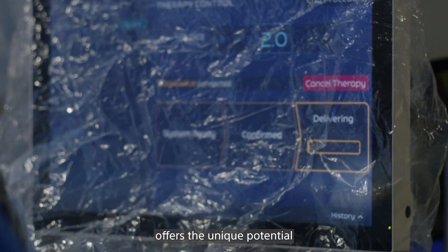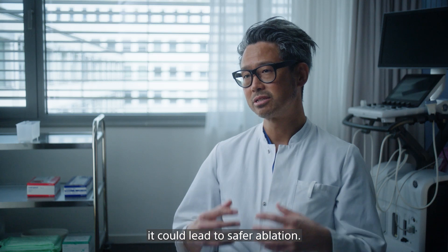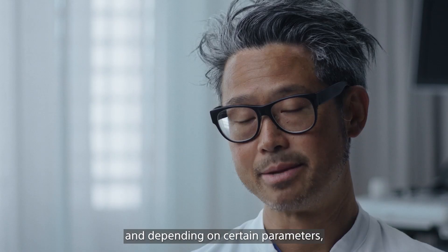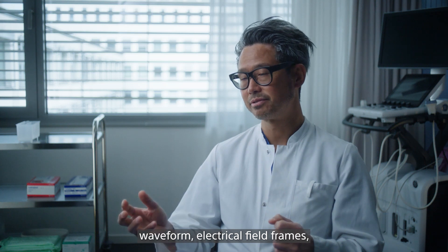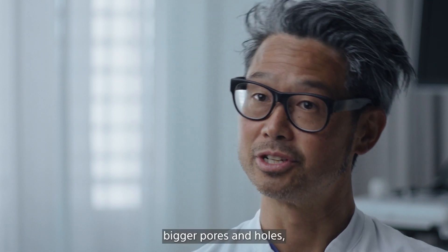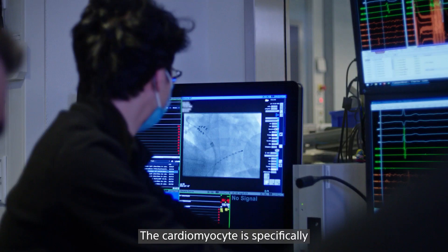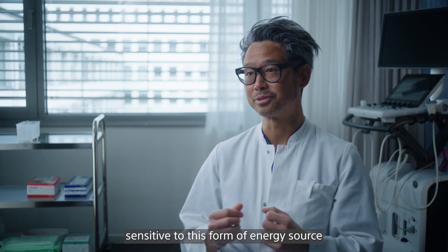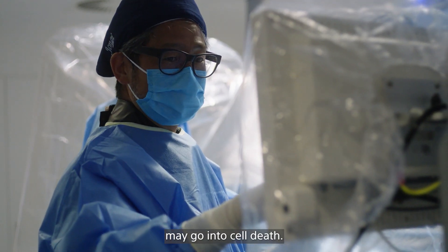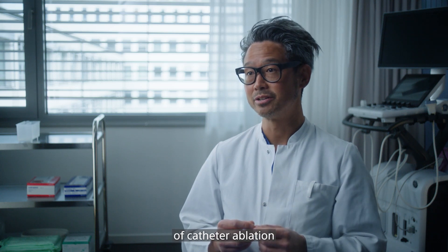Pulse field ablation offers the unique potential to produce a lesion without heating or cooling down tissue, and therefore it could lead to safer ablation. PFA creates an electrical field over a cellular membrane, and depending on certain parameters — waveform, electrical field strength, duration, etc. — the cell opens up. If you have bigger pores and holes, the cell will not be able to close again, and this is electroporation. The cardiomyocyte is specifically sensitive to this form of energy source, and thereby the myocyte only — but not the nervous cells, not the endothelium, and not the oesophagus — may go into cell death. This is the attractiveness of pulse field ablation in the context of catheter ablation for cardiac arrhythmias.